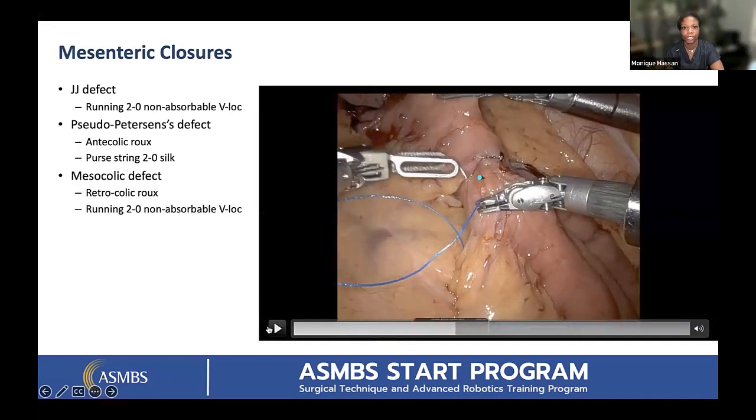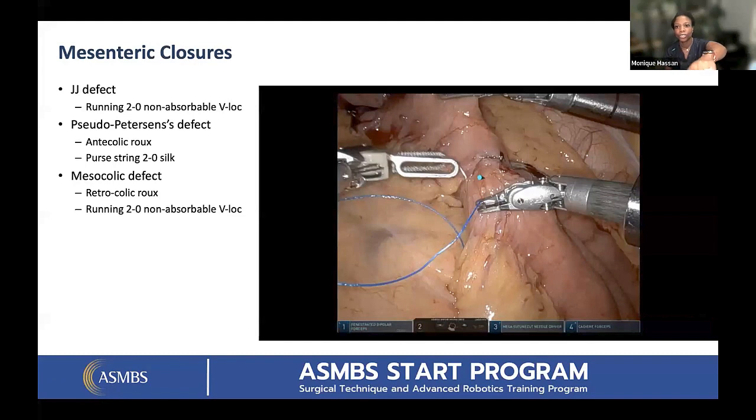And I actually will take that cut edge. The end that you have at the end of the BP limb is pretty long for where I would make my enterotomy on that side. Then I pull the Roux limb up and roll it over, kind of like a roll-in stitch basically, and it ends up rolling in that staple line a little bit.